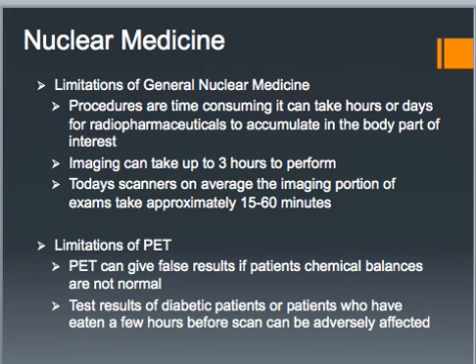I mean, the whole procedure itself can take multiple days depending on what we're doing, like the white blood cell count. You know, the patient has to come in one day and then come back the next day. So, you know, that is a limitation.